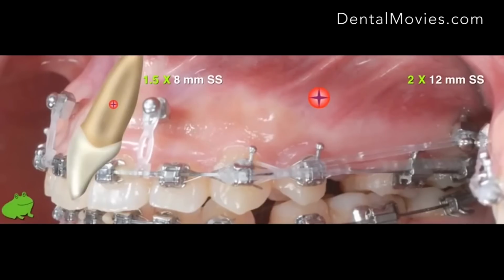The upper anterior mini screw is 1.5 by 8 stainless steel, posterior 2 by 12. With that, look carefully at the center of resistance for the tooth and for the entire maxilla. If I am wrong, prove me wrong.